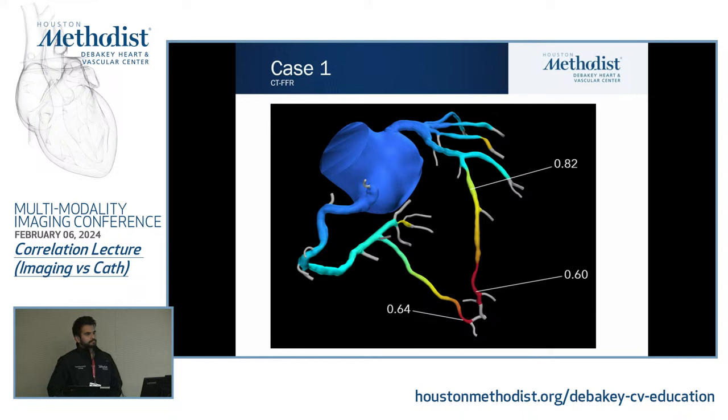Now, I agree with Sumin that the most specific way to interpret FFR is to look 1 centimeter or 1.5 centimeters below that lesion, the mid-LAD. Technically, you can argue that the gradient FFR across that lesion is not significant. But if you go by the guidelines, it doesn't tell you that. So anything below 0.8, and you can see the tip of the vessel is 0.6. So by QA criteria, this guy needs cath and needed the FFRCT. Probably he's not going to benefit much because of the diffuse nature of the disease and because there is not a huge translesion drop in pressure, as Sumin mentioned.